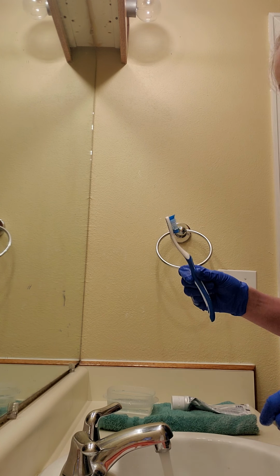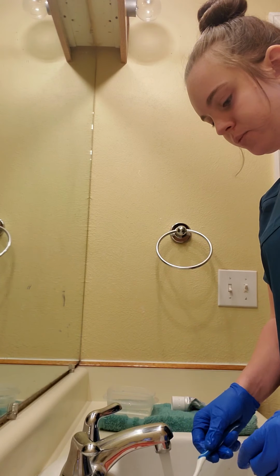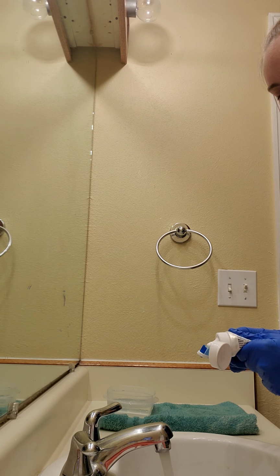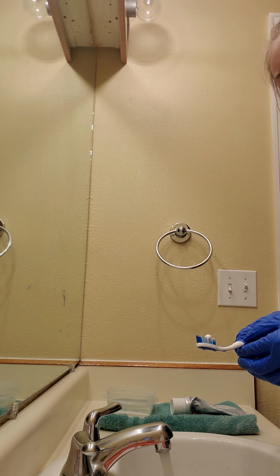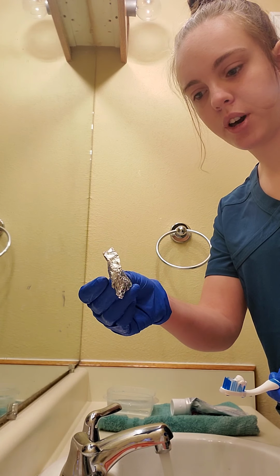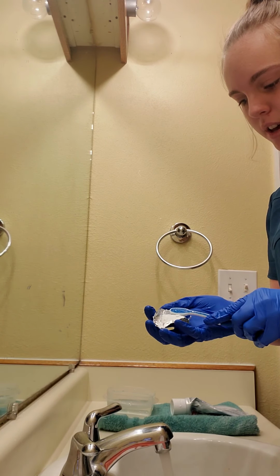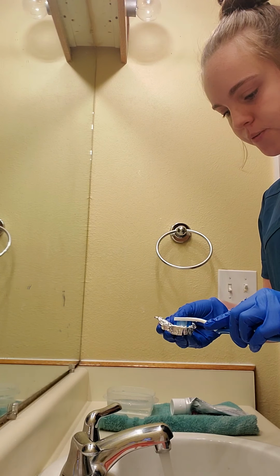The next thing I would do is I would get their toothbrush and I would rinse that. I would then get toothpaste and apply the toothpaste. I would then get their dentures that I have made a mold out of with tin foil. And I would start washing all surfaces of the dentures, including the gums, the front and back of the teeth, the chewing surfaces.